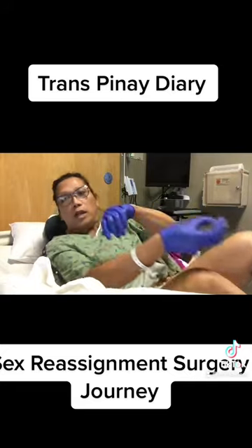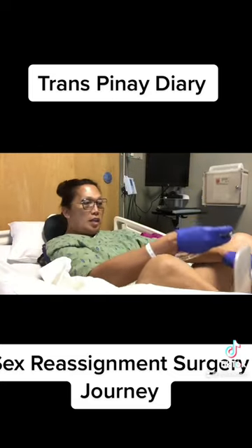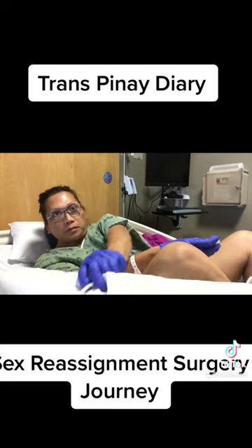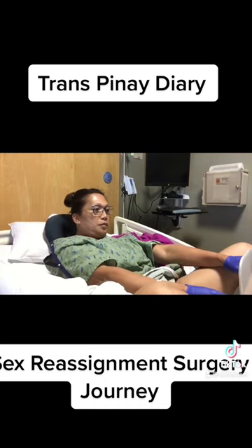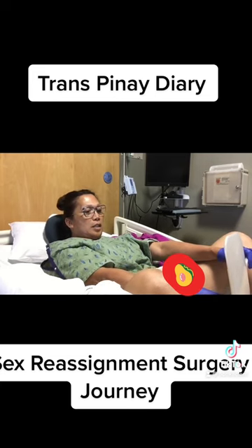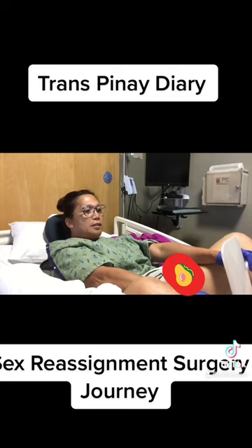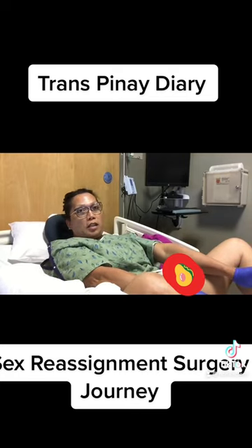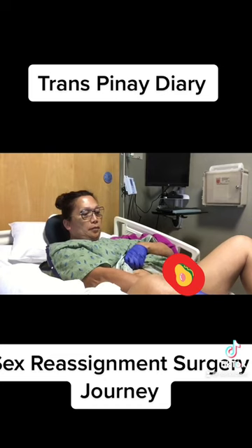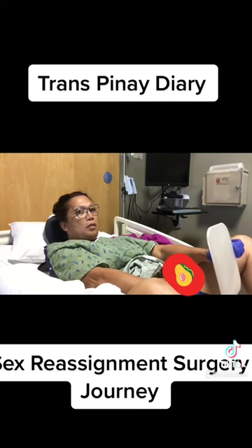So it's gonna be soft and smooth once you put it inside. Now I'm gonna do it with the help of my magic mirror — with the help of this mirror. Okay, I'm gonna do it today. Lift your leg up a little bit. It's a six-inch one, so we have to do it to maintain the depth. You have to push it slowly and always look in the mirror.